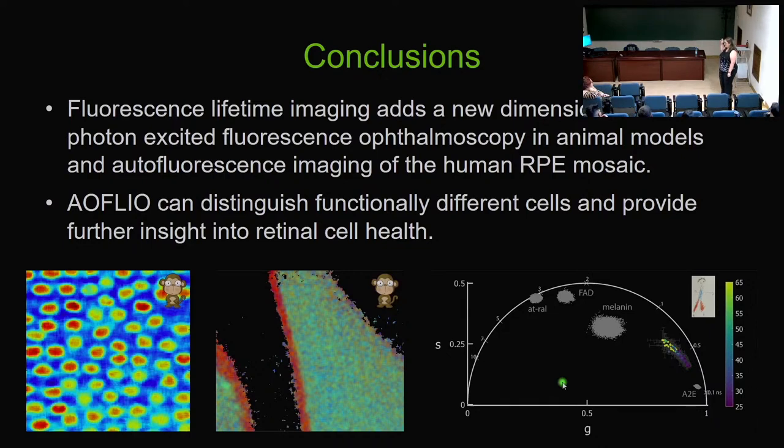Does it matter? Yes. I'll give you an example of data I didn't show. We have done some work with extrinsic fluorophores, adding fluorophores that have a lifetime variability and trying to measure those. We put them in RPE cells. RPE cells are very fluorescent with a lot of lipofuscin. And the expression of the fluorescence that we put in is variable. And so that background lipofuscin fluorescence can really overshadow, in some cases, the expression of the cell and the fluorescence that you're actually trying to measure.